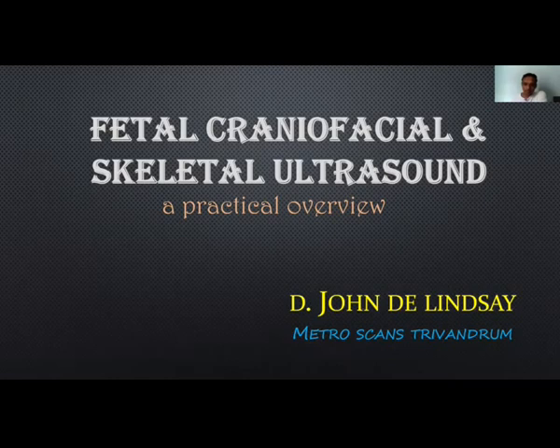And the topic today is fetal craniofacial and skeletal ultrasound. It's more of a practical overview. And over the next 45 odd minutes, I'll try and underline the practical aspects of craniofacial and skeletal ultrasound.